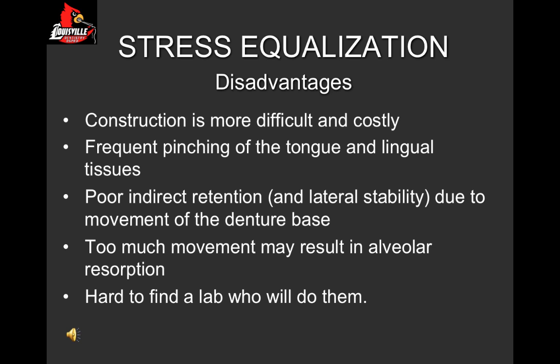Why don't we see more of this type of partial denture out there? First of all, it has some disadvantages. Construction is much more difficult and costly for the partial denture. And you also saw frequent pinching of the tongue and the lingual tissues.